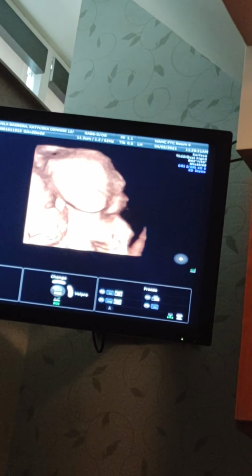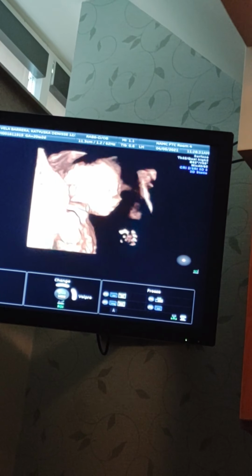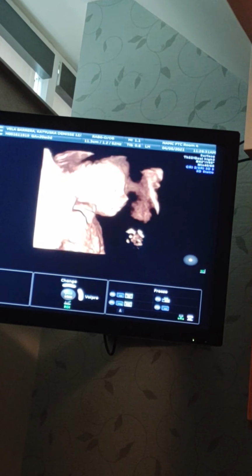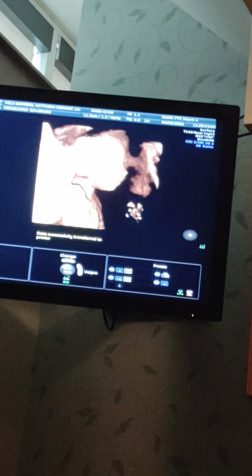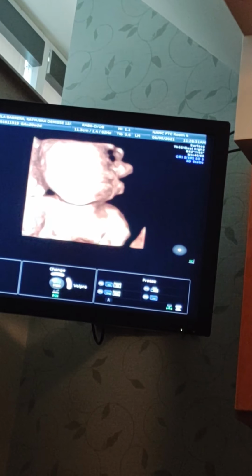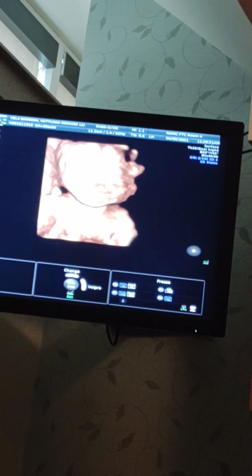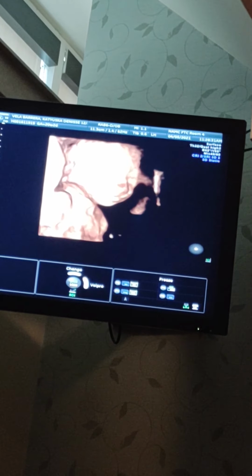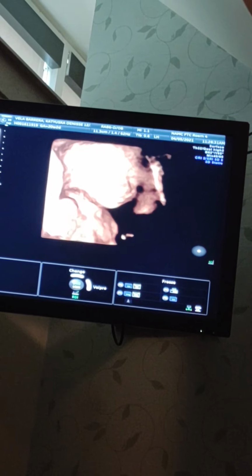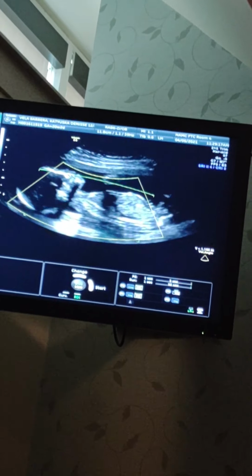Now, let's see. Don't forget, your whole baby is only like 10, 12 ounces. So there's not much to baby yet, not a lot of flesh. So it's going to look scrawny and kind of bony. When they're bigger, it gets more clear, like a real photograph would be. This way, it's just kind of, you know. I see the lips there a little bit. Baby's still shadowy. Too small. Yeah. Just wanted to try it though.